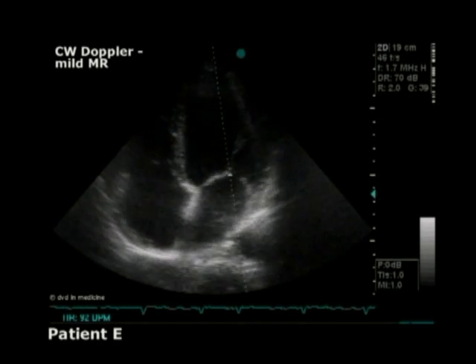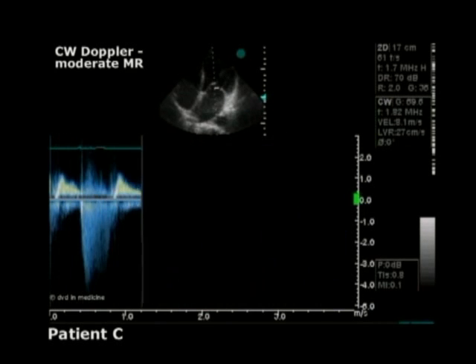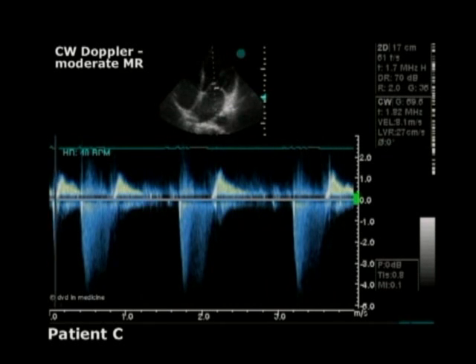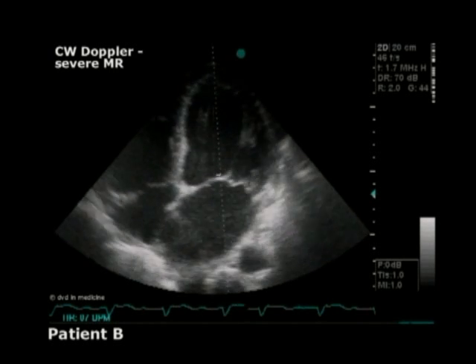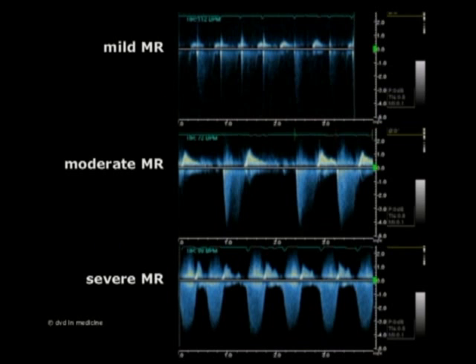There are some spectral Doppler findings which may assist an examiner in determining the severity of regurgitation. The method for determining the severity of mitral regurgitation using spectral Doppler relies on the subtle comparison of diastolic flow, seen above the baseline, to the regurgitant systolic flow seen below the baseline in brightness. Simply expressed, the brightness of any Doppler signal reflects the number of red blood cells moving through a Doppler sample if spectral Doppler gain settings are properly set.